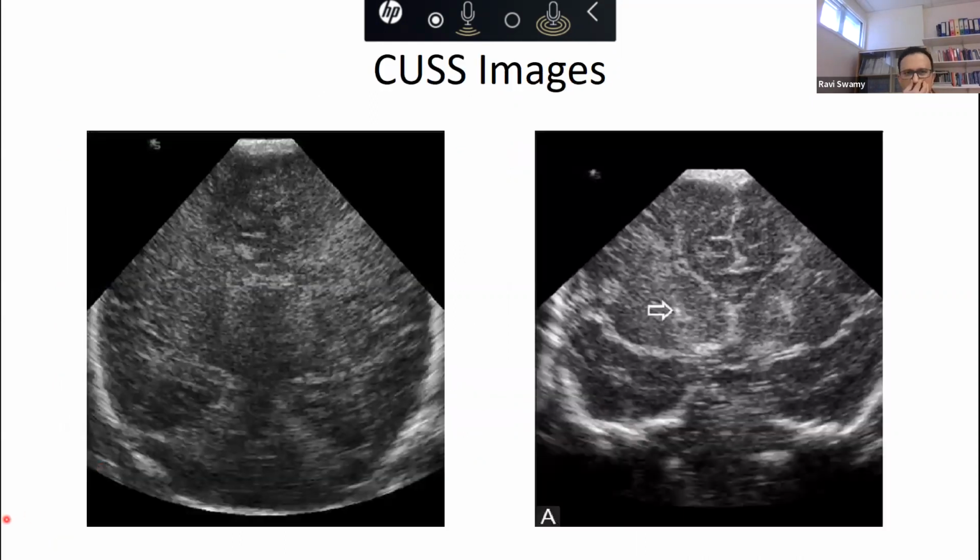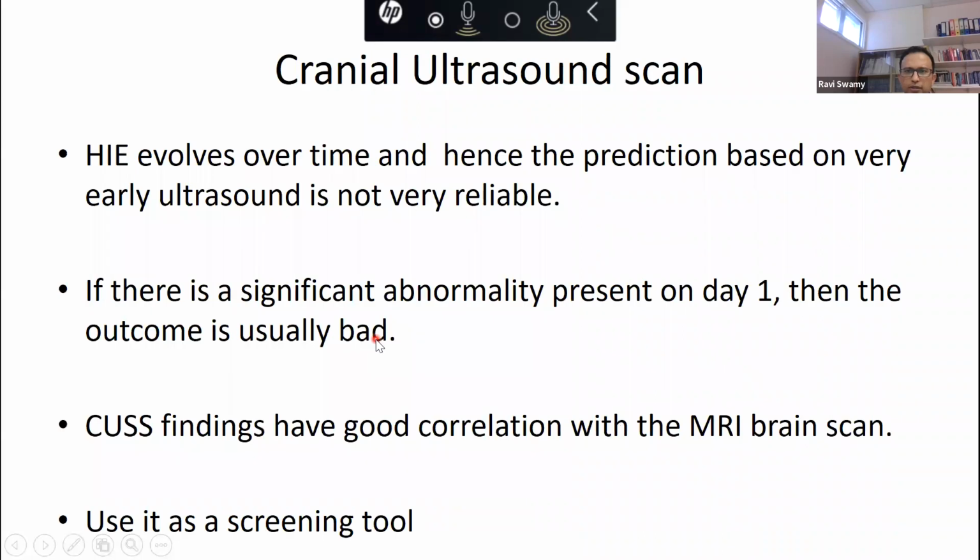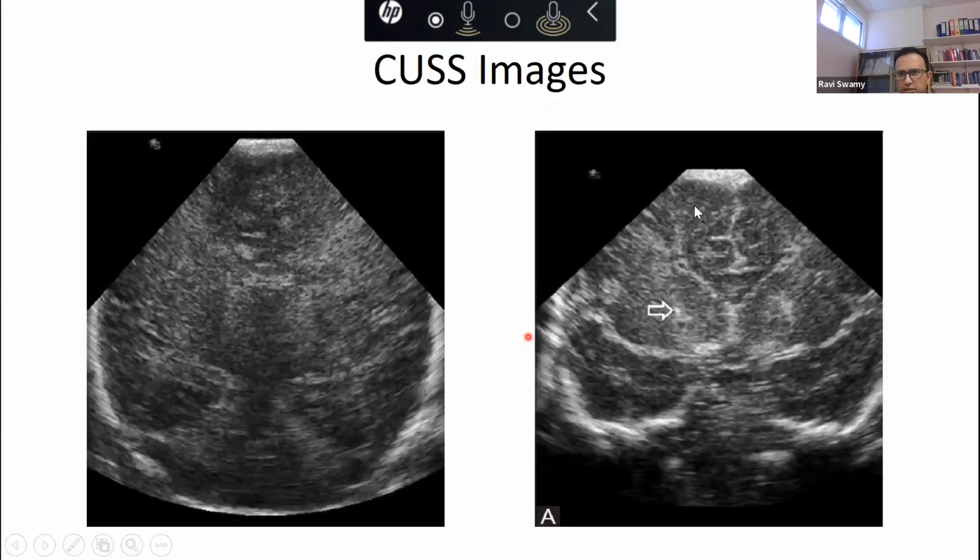Right. So how does cerebral edema look? If you see this image on this side, you will start seeing the sulci and gyri. This is the interhemispheric fissure. You will see some sulci and gyri. When you come here, you don't see any sulci and gyri. So absence of sulci and gyri is the main thing you look for in cerebral edema. In cerebral edema, the edema is so much that you lose the sulci and gyri. So it's completely like a very mashed section.